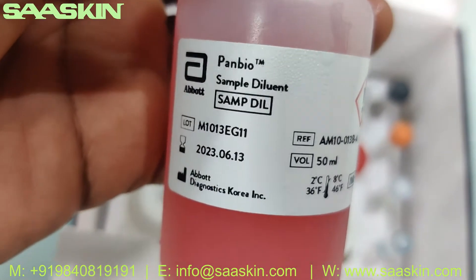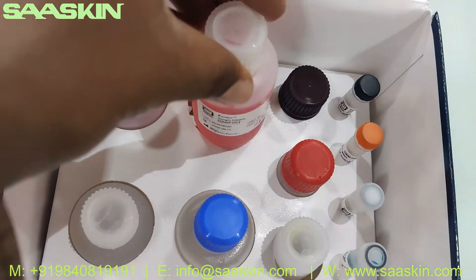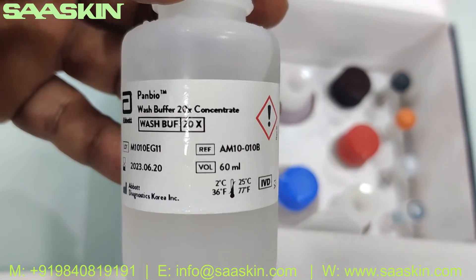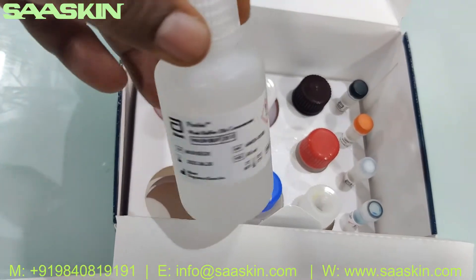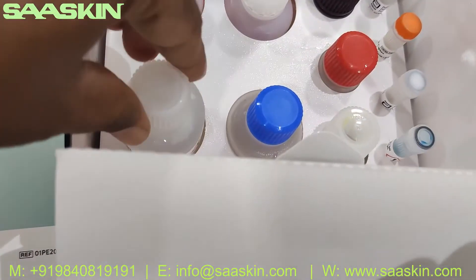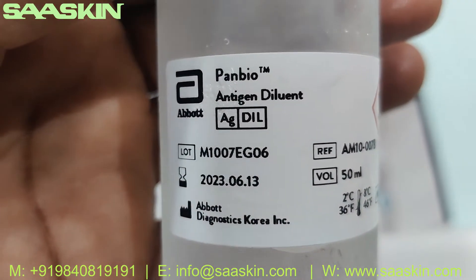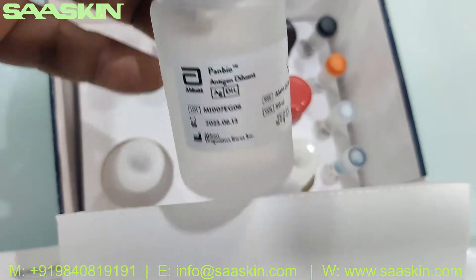You also have one more bottle of sample diluent, 50 ml. Next you have the wash buffer 20x concentrate — 60 ml bottle. And you have the antigen diluent, 50 ml.